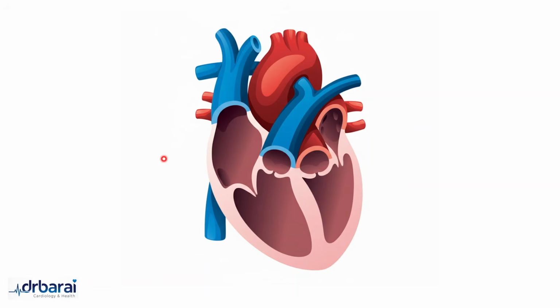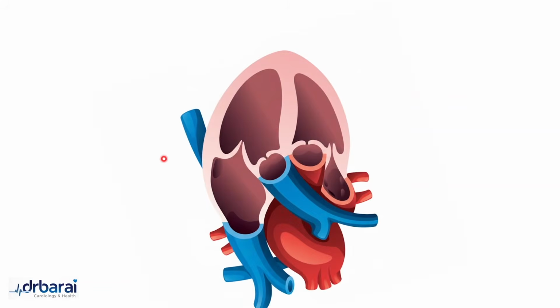So when we do the echocardiography, of course, the heart is flipped upside down, right and left are flipped as well. So once again, that's the interventricular septum, vertically oriented. This is the left ventricle, this is the mitral valve, this is the left atrium, and this is the aortic valve, and there is the ascending aorta. And this area is the left ventricular outflow tract.